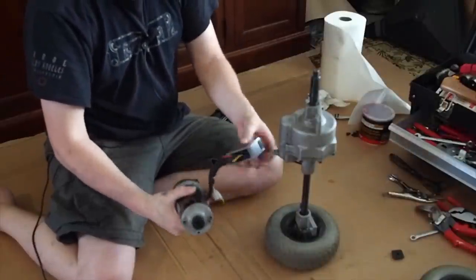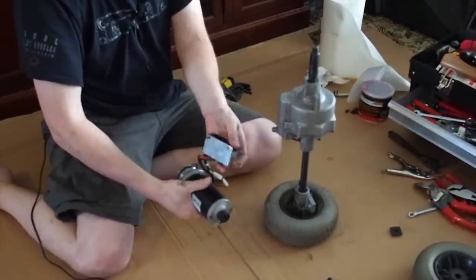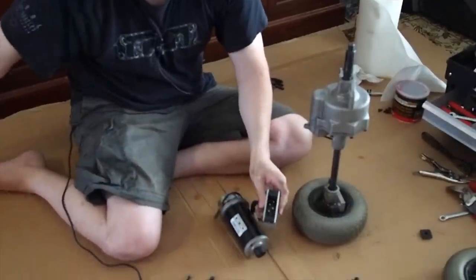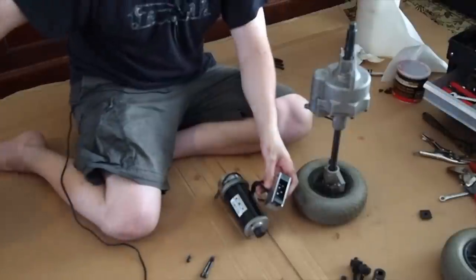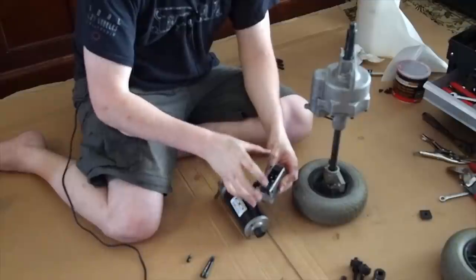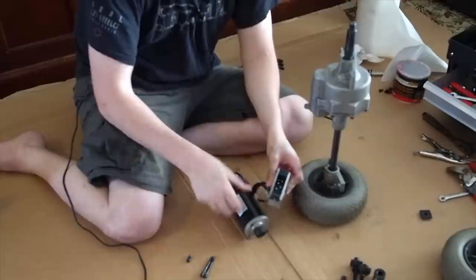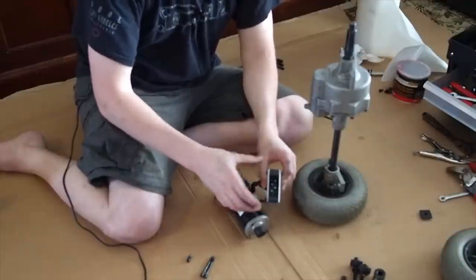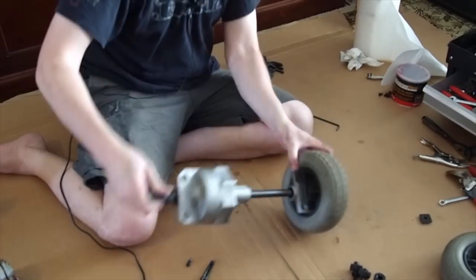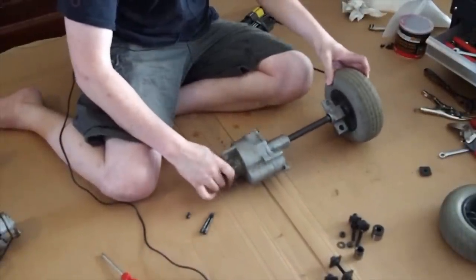All right, here's the motor. This is one of the pieces that I talked about last time that has these pins. They have one that goes between the cage and the front part, and that's this one here. There's not a lot of vibration between the back and the front, so there hasn't been a lot of problem with these pins opening up the connectors on the other side. The issue has always been the pins that are connecting to the battery. All right, so this is pretty much ready.